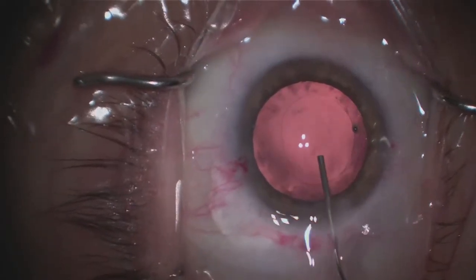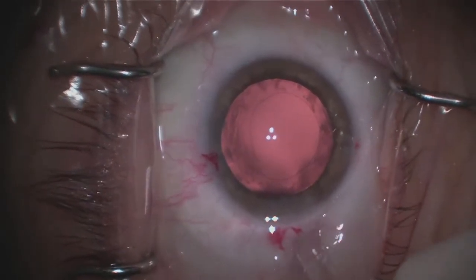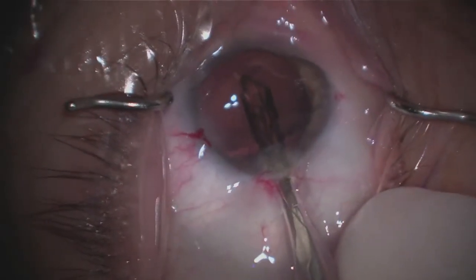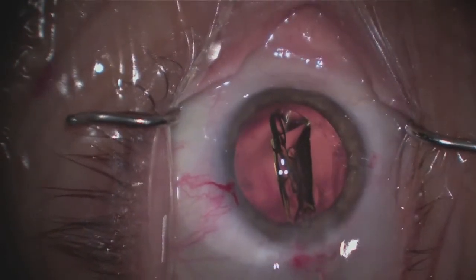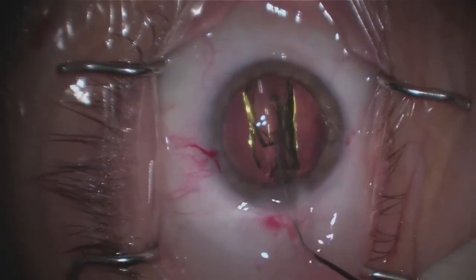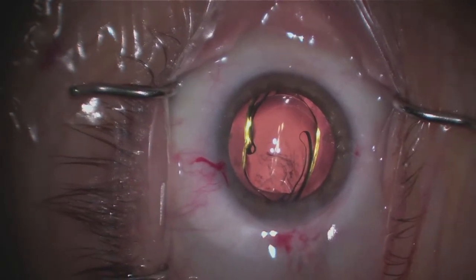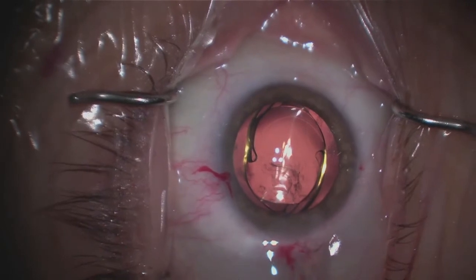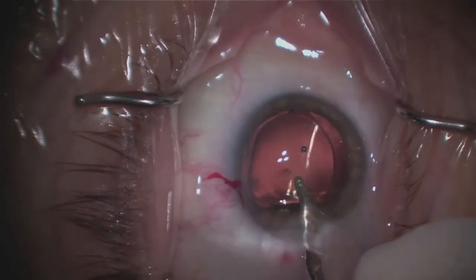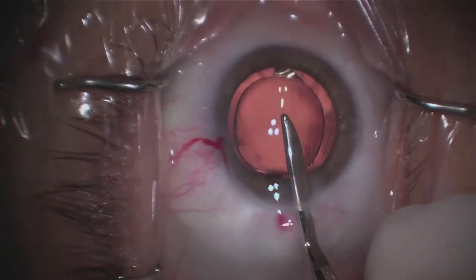In this next step, I'm placing some more gelatinous material inside the bag, because next I'm going to place the lens implant, also known as the intraocular lens or IOL. Patients will often feel just a slight amount of pressure. This lens is coiled up small enough to fit through an incision of about 2.2 millimeters. It has a slight yellow hue, and as you'll see it unravels and opens up. The arms of the lens are known as the haptics, and the central magnifying portion is known as the optic.